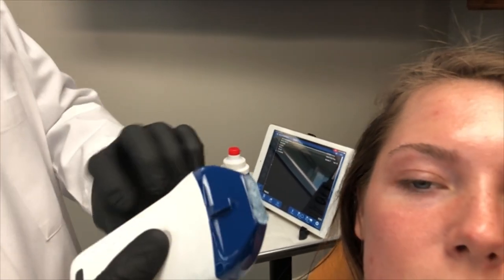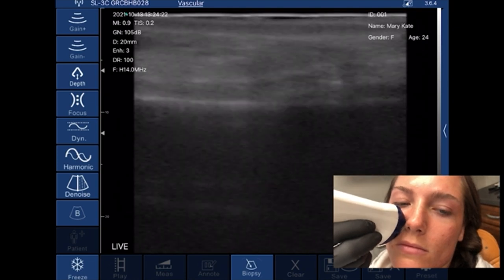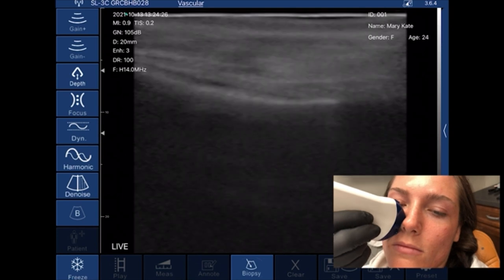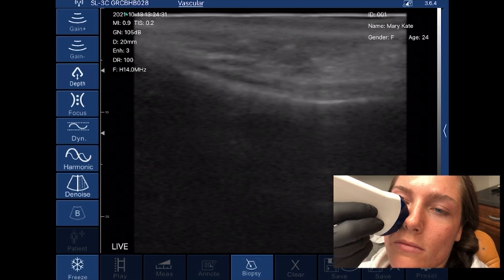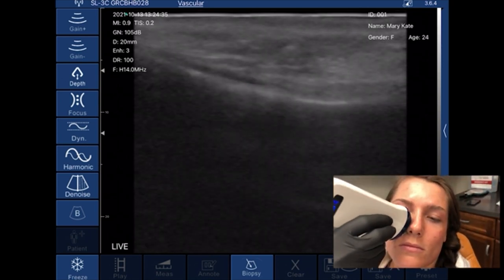Now we are going to place it. I'm going to turn you this way just a little bit, Mary-Kate. We're going to place it right there and see what this looks like on the image. Now we can go ahead and take a look at the image, and what we are going to be looking for is that deep piriform space — and we can see it right there.